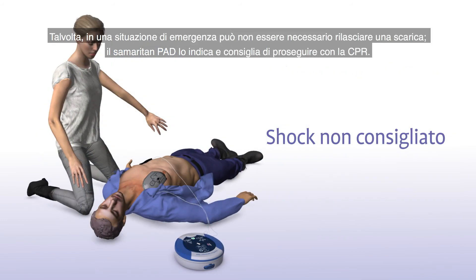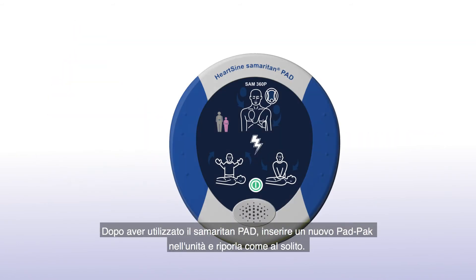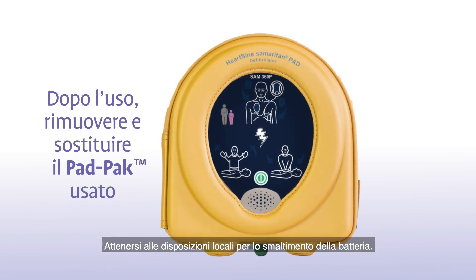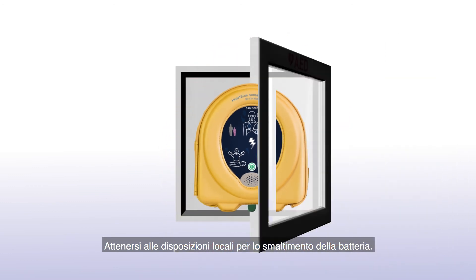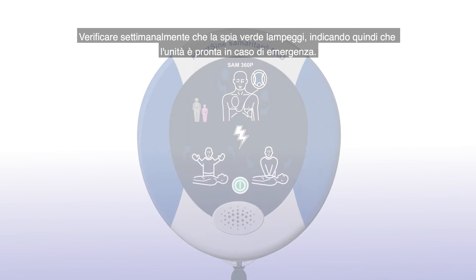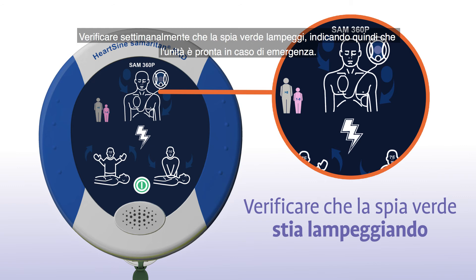Sometimes no shock is needed in a life-saving situation, and the Samaritan PAD will tell you in that instance or advise you to continue to perform CPR. The device will announce: "Shock non consigliato." After using the Samaritan PAD, slide a new pad pack into the unit and store it as usual. Remember to follow your local battery disposal guidelines. Once a week, check that the green light is flashing so you know the unit is ready in case of an emergency.